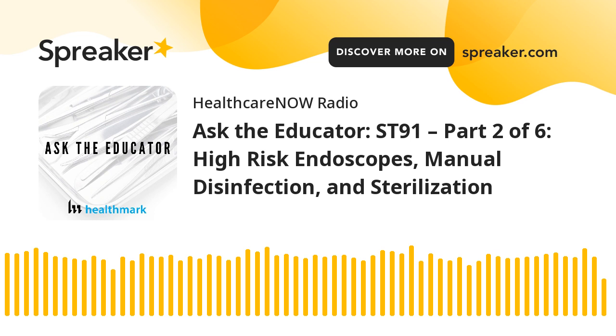And by cleaning verification, I mean things like tests for protein, tests for hemoglobin, combination test strips, protein, carbohydrate, and hemoglobin together, or ATP. They all qualify as cleaning verification. And we never tell you within a standard what product you have to use. We'll just tell you that you have to do something and you need to figure out how to do that. So every high risk scope, every time, for cleaning verification.